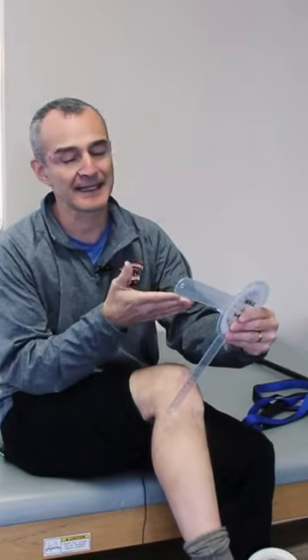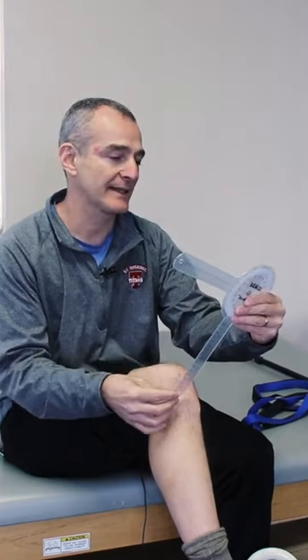I'm going to bend my knee as far as it'll let me go. Now I can look at it and I can see what my measurement is. Right here, I'm looking at 84 degrees.